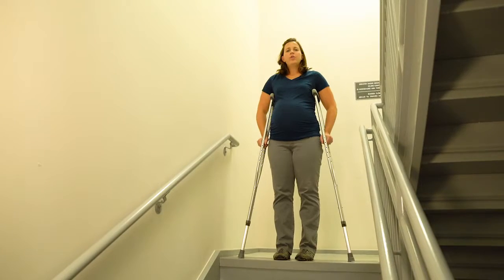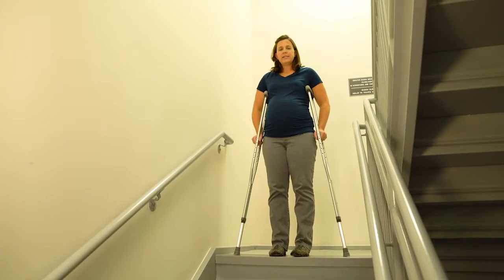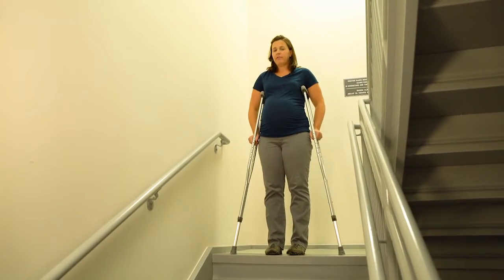If you are not weight bearing, I highly recommend a family member to be near you for the first couple times that you do the stairs. Have them stand over on your affected side and slightly behind you. You can also put a belt around your waist and have them hold on to the belt to help keep you steady and safe.